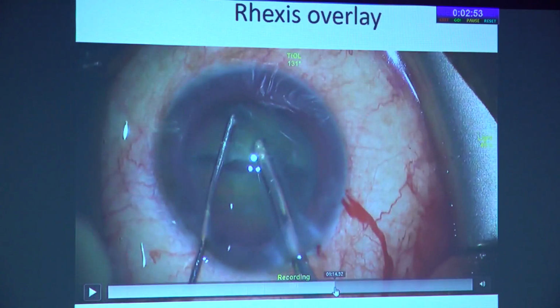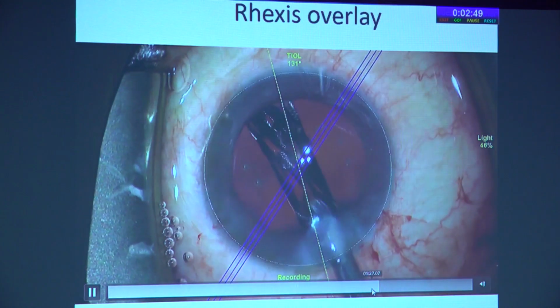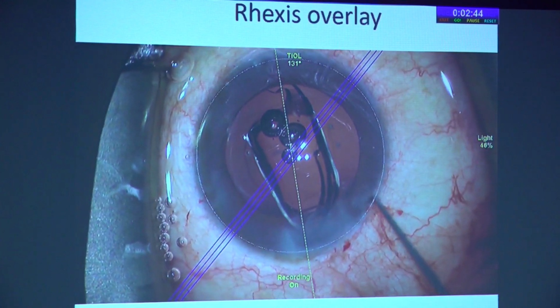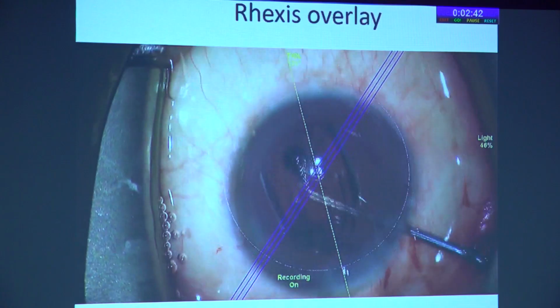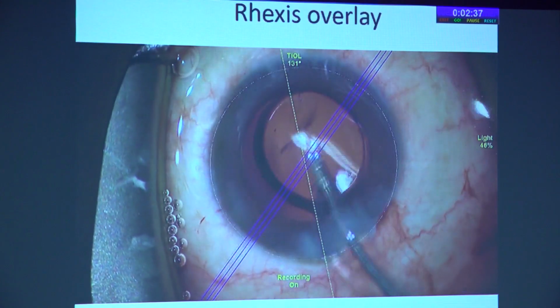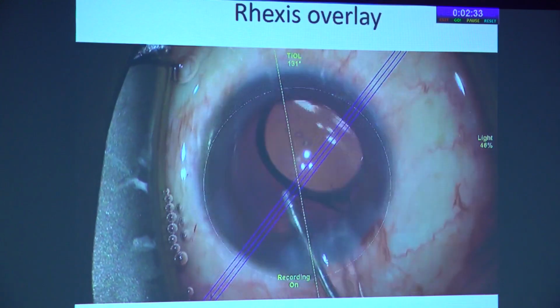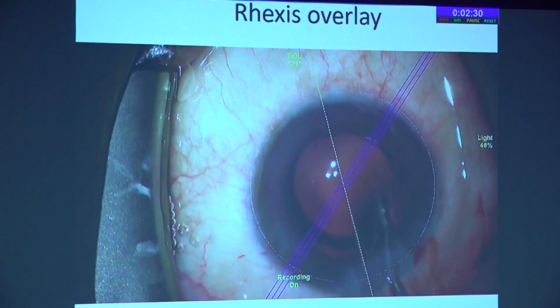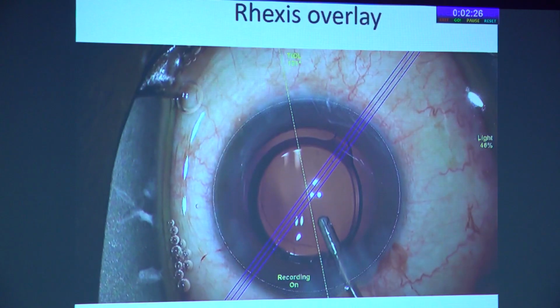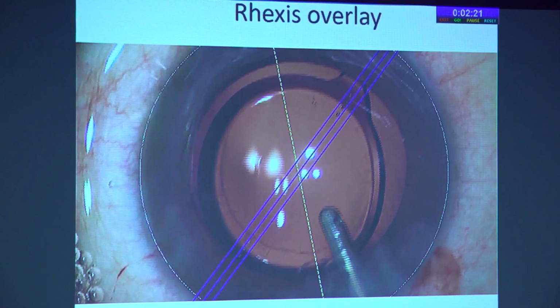I'm going to skip all of that and just go to the implantation per se. As you see here, again the IOL is being implanted. The yellow line will be representing the 180 degrees, and this toric IOL is being implanted at the 131 degree mark. You just have to align it along the three blue lines and ensure the toricity marks are on the central blue line. So this is here at the end of surgery, and also you have to ensure that you evacuate the visco under the IOL to ensure that the IOL doesn't rotate in the early post-operative period. You just have to align it on the central blue line. That's about all. At the end of surgery, you hydrate the incision and you can close up.